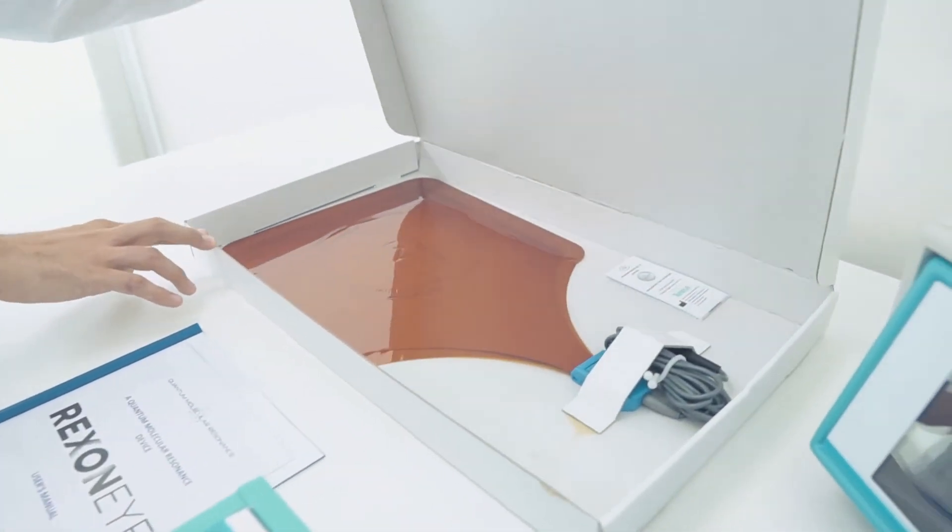Hello, I'm here to show you how to set up and use the Rexon Eye device.